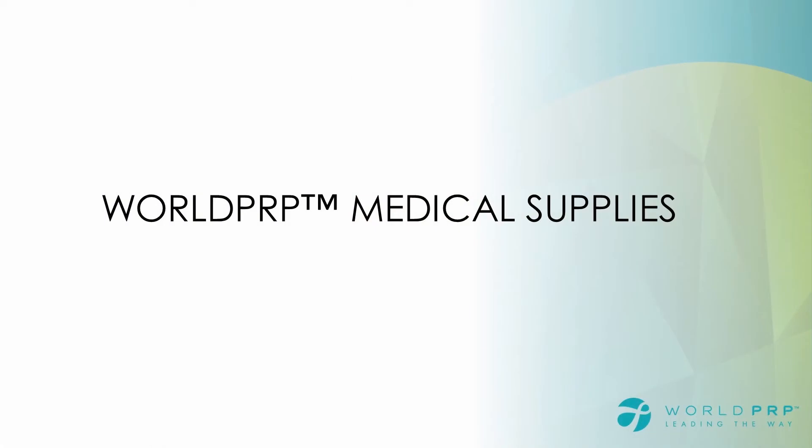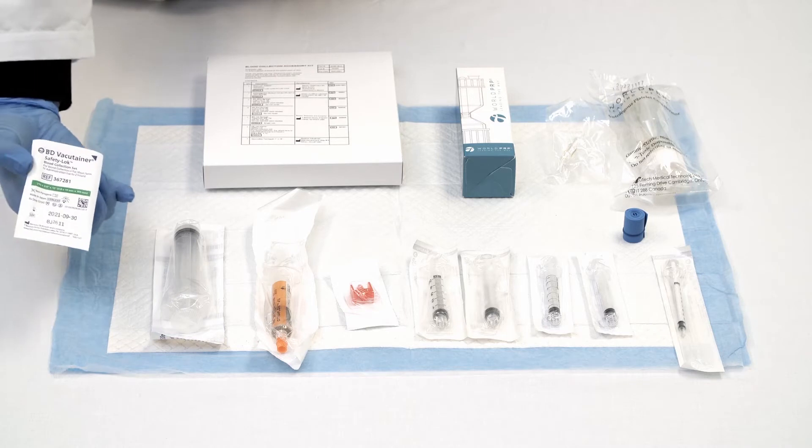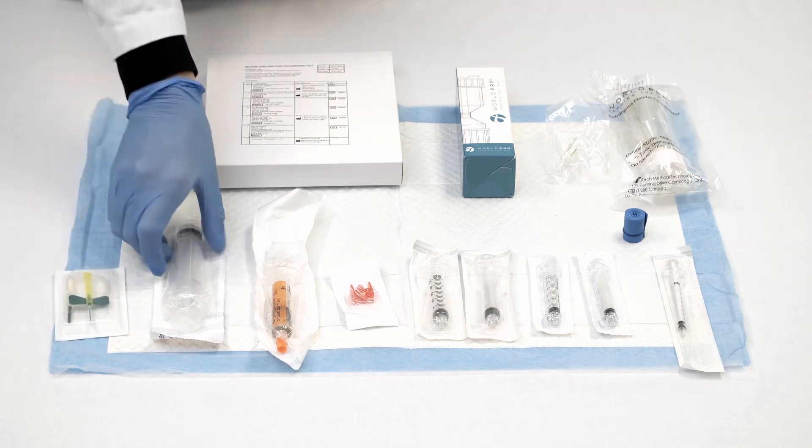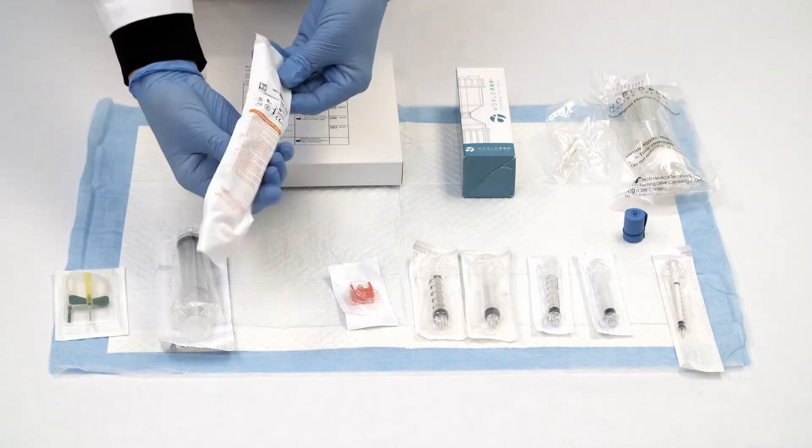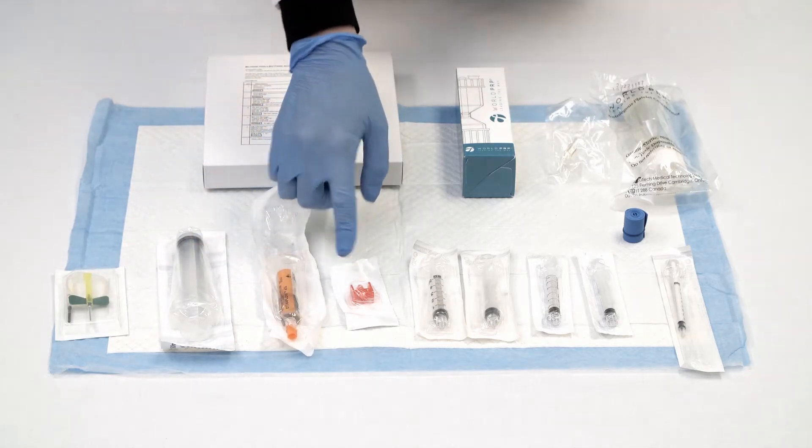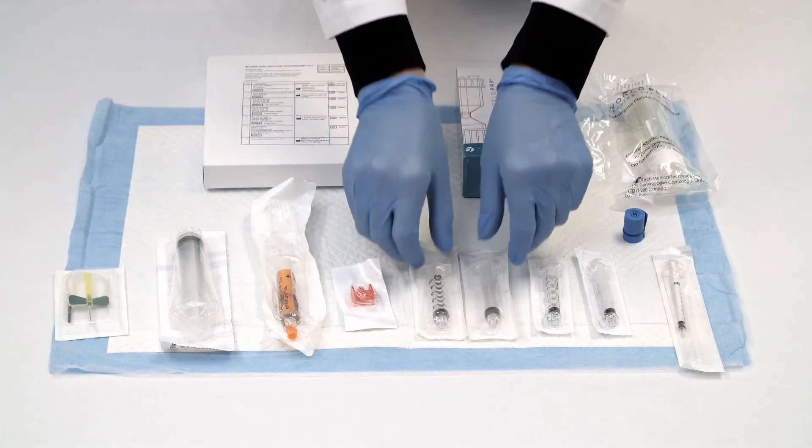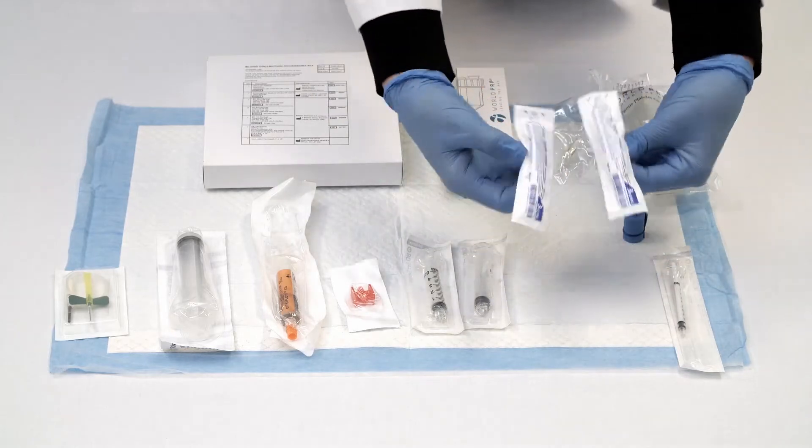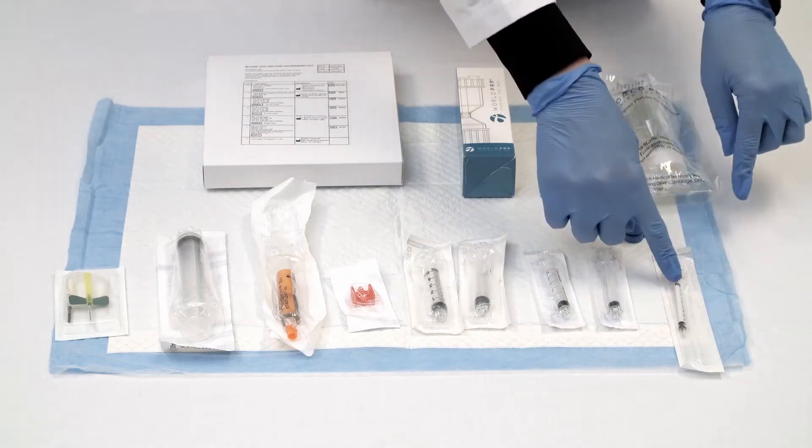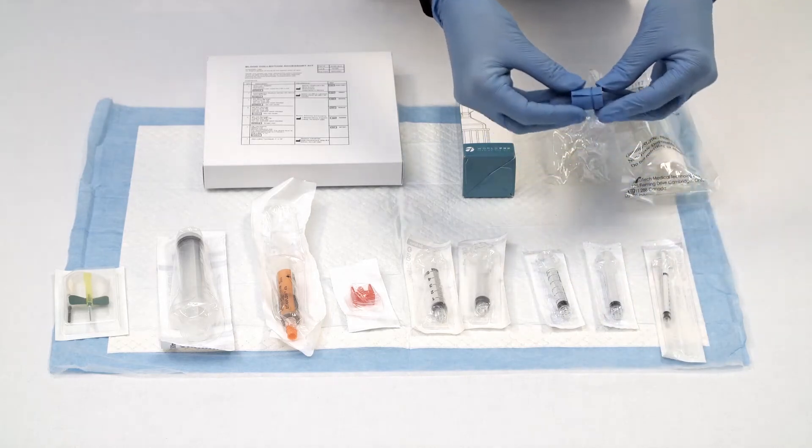I will now walk you through what is included in the blood draw kit. The blood draw kit includes a 21 gauge butterfly venipuncture, a 30 ml syringe, a 10 ml syringe of sodium citrate, the anticoagulant, red luer adapter, luer lock to luer lock tube connector, two 5 ml syringes, two 3 ml syringes, a 1 ml syringe, and a non-latex tourniquet.